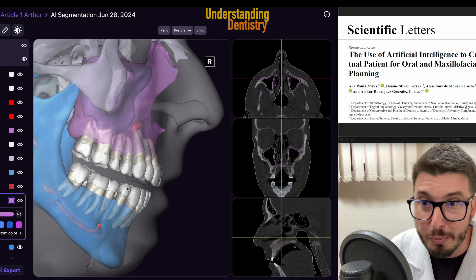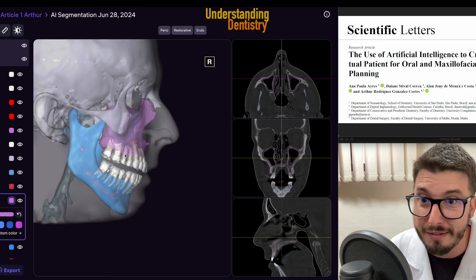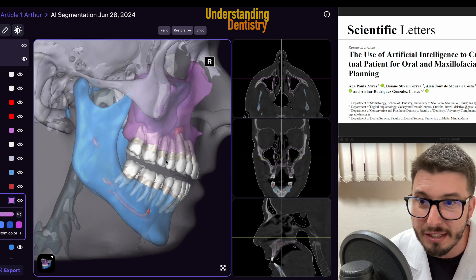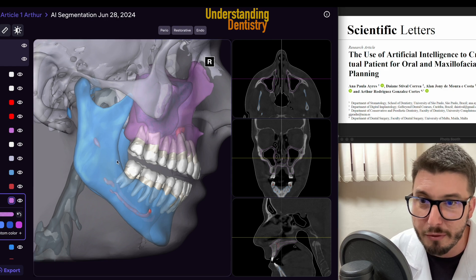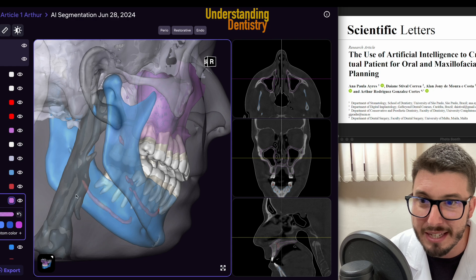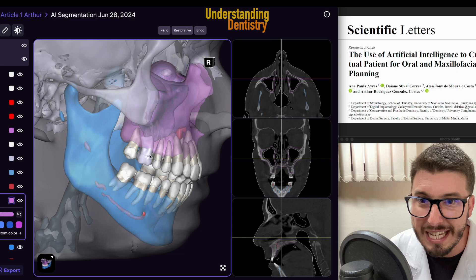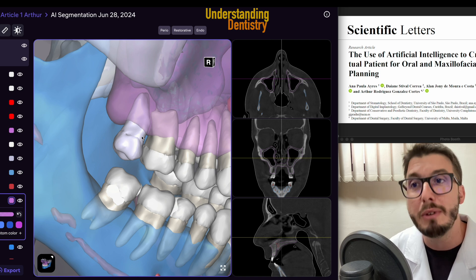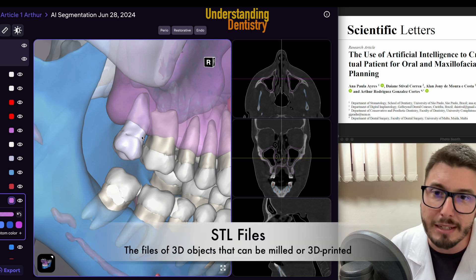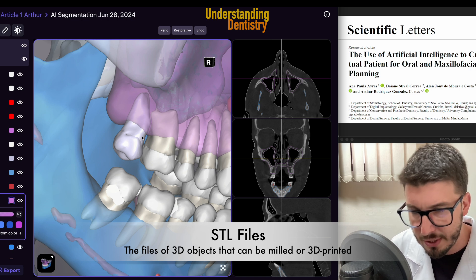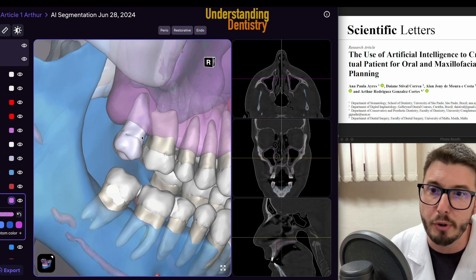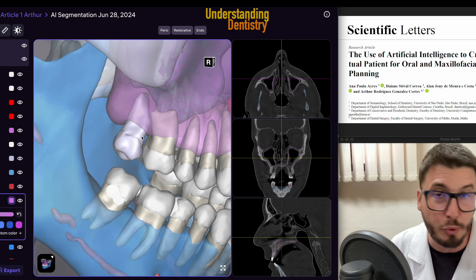Here we have the virtual patient. All those structures are automatically segmented for you. We have even the airspace of the patient — so the airspace is here, completely segmented. The mandible is segmented automatically, each tooth is segmented automatically, and they can be exported as individual STL files. That means each tooth can be imported to a different design software, which is very useful for diagnosis and treatment planning.